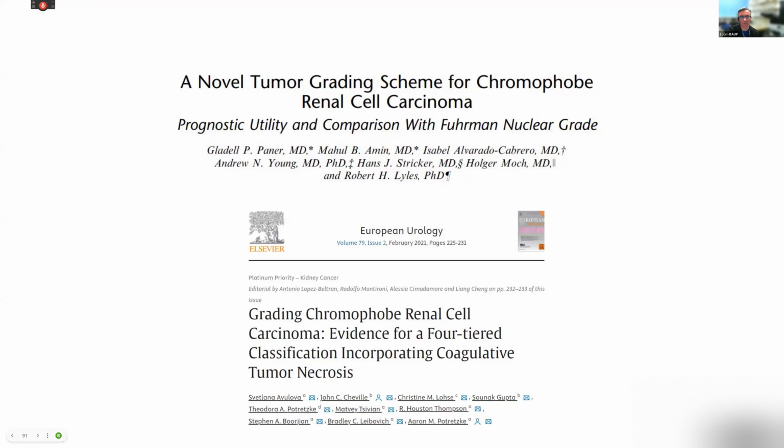And before we go on to the questions, I've got 2 papers that, if people are interested, they can go and look at. There are 2 papers out there that have described grading systems for chromophobe. The Paner paper from 2010 describes a 3-tier system of grading chromophobes where the pleomorphism is discounted, but it's more related to the concentration or the nuclear crowding.